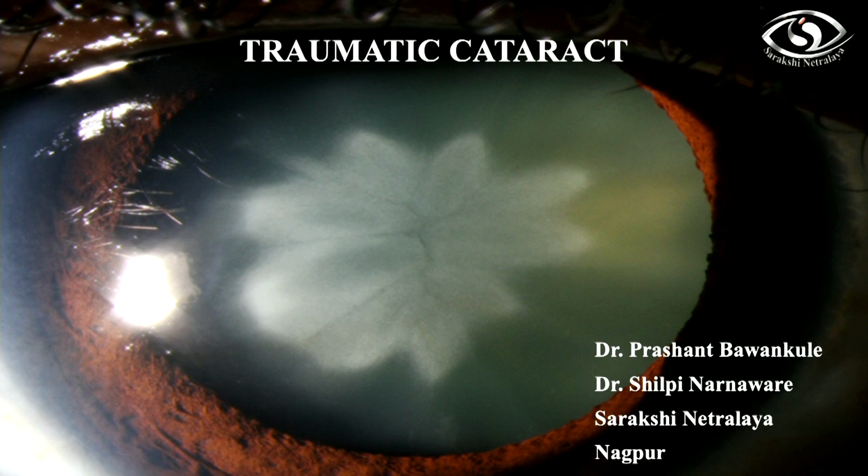Friends, I would be sharing some of the pearls of traumatic cataract management. JK, you had shown that soft lenses with the soft-tipped injector, no? The silicon injector, where the haptic is getting stuck. So many times the haptic gets broken off. You said you can cut it somehow?